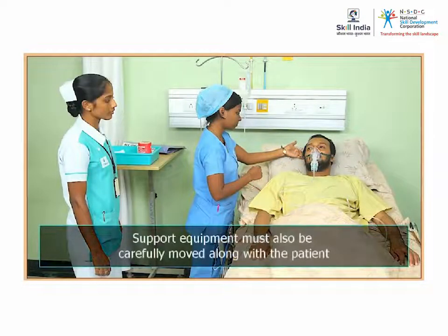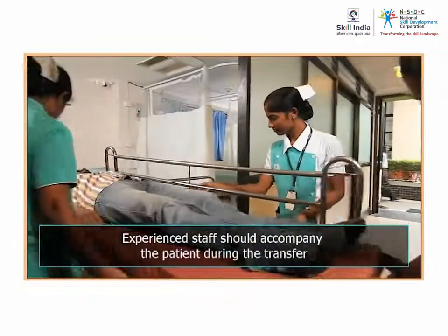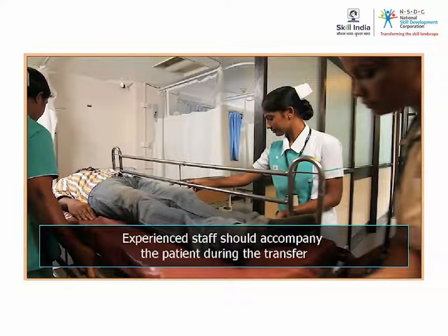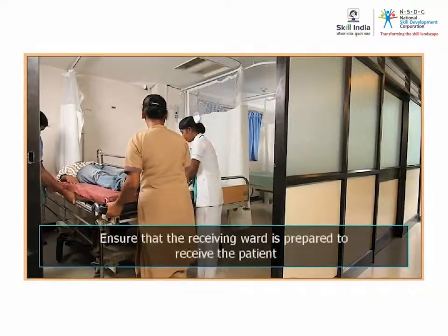The patient might be provided with medication and support for breathing. In such cases, the support equipment must also be carefully moved along with the patient. Experienced staff should accompany the patient during the transfer, and appropriate documentation and equipment should be available. The receiving ward should also be prepared for the patient. Ensure that you organize the facilities that are required for the transfer.